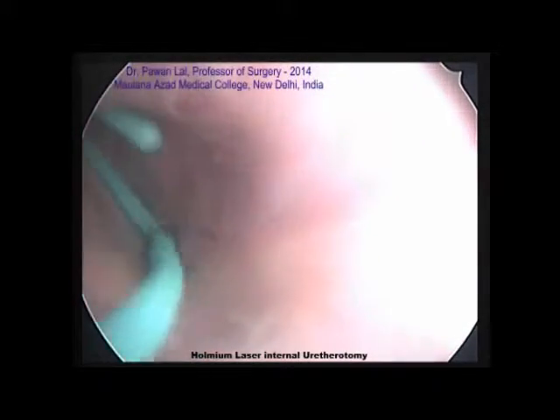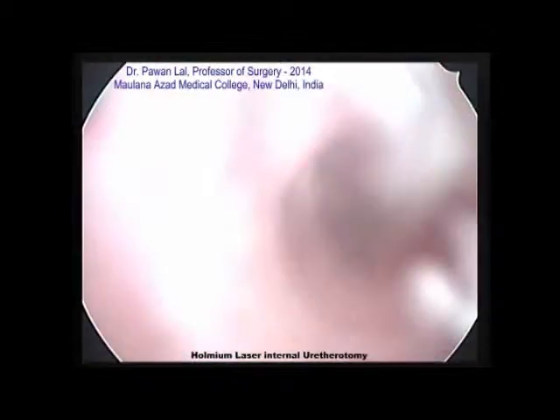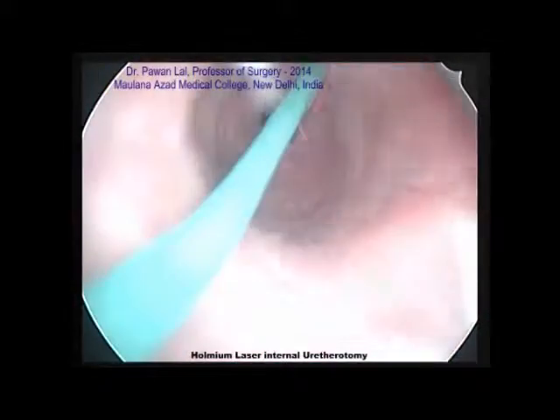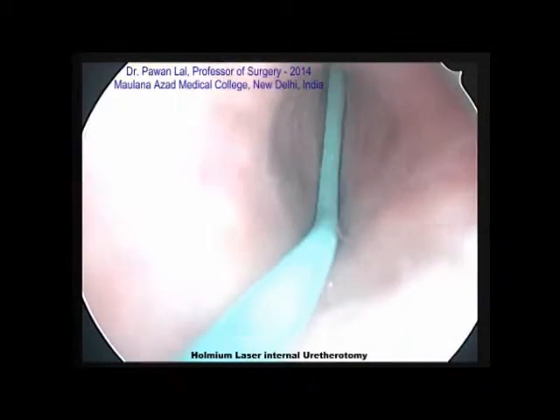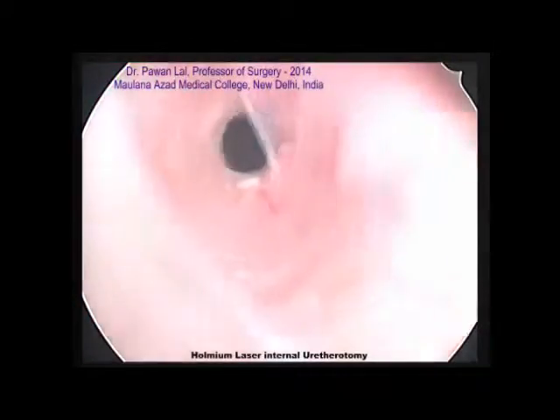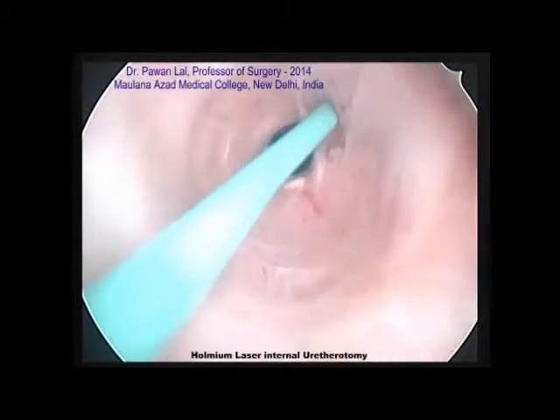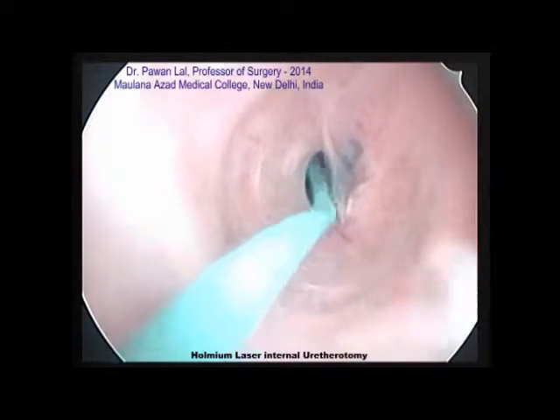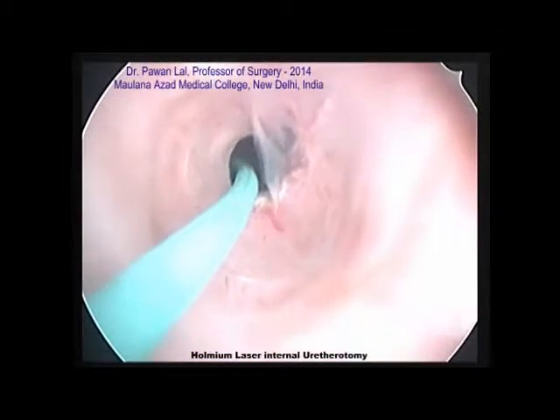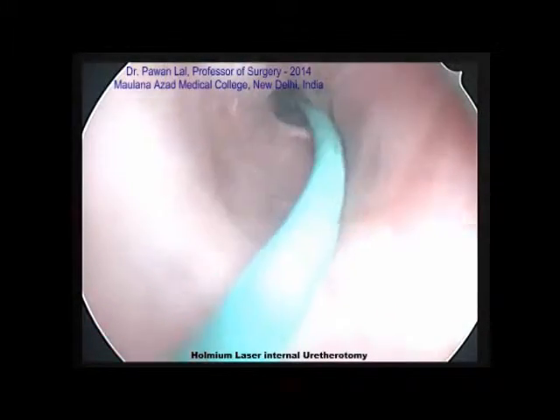The advantage of holmium laser internal urethrotomy is that there is hardly any bleeding. The first step when I start with internal urethrotomy is the passage of the guidewire through the stricture. Once we are able to negotiate the guidewire, half our problems are over, because if we are not careful we can go outside the urethra and that can create a false passage.